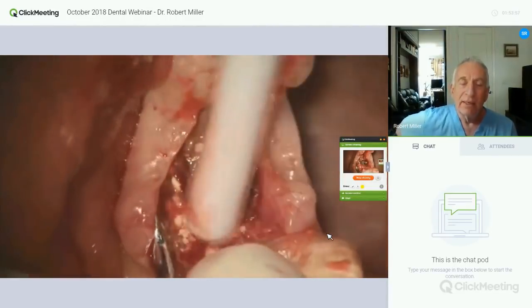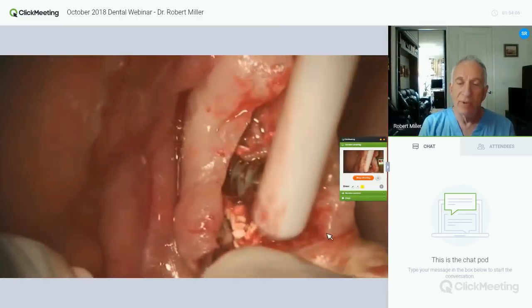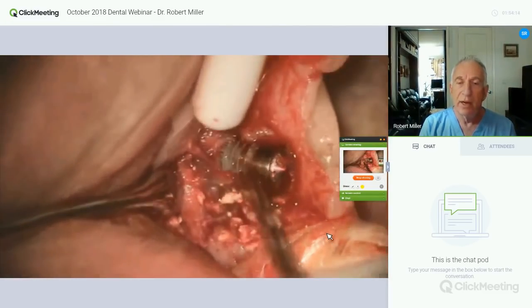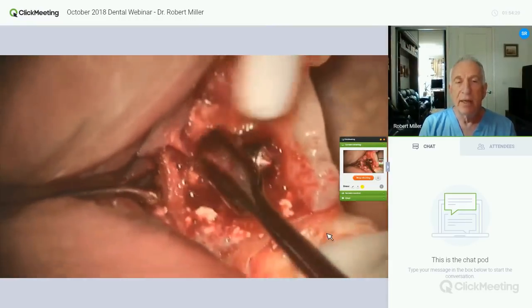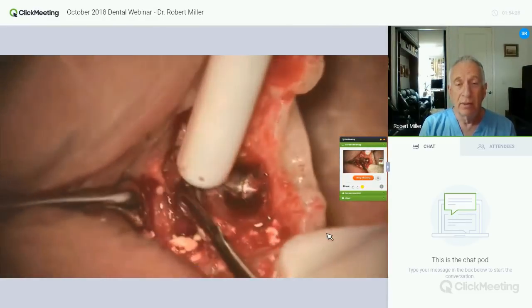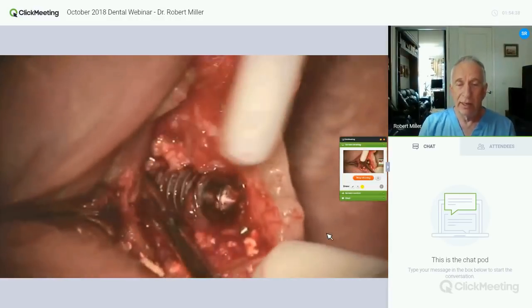I don't want this, because if it becomes really fibrous encapsulated, it actually becomes bad for the bone. It actually causes more bone loss rather than regenerating more bone. And for these cases, you have to remove 100% of your graft material if you intend to regenerate anything around. Unfortunately, this defect, treated as a foreign body reaction, this defect was so large, all I did was unscrew the implant and it was gone. So I don't want to see you using a non-resorbable HA, from xenograft to high-density HAs as alloplast.